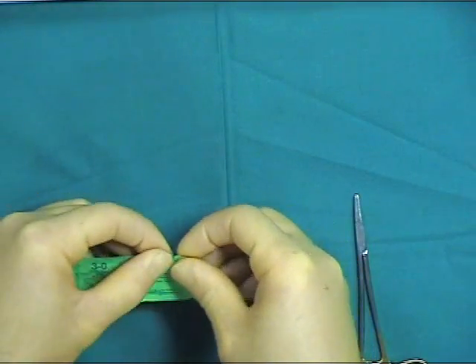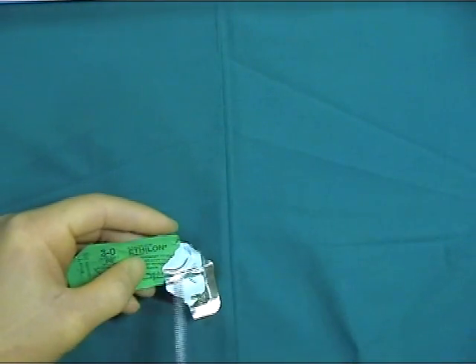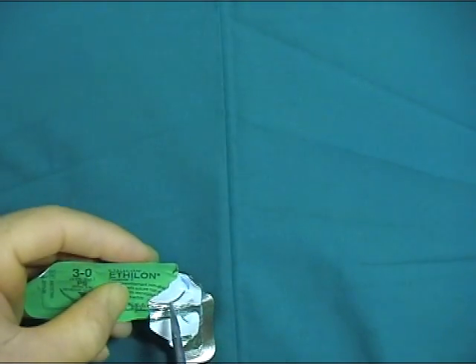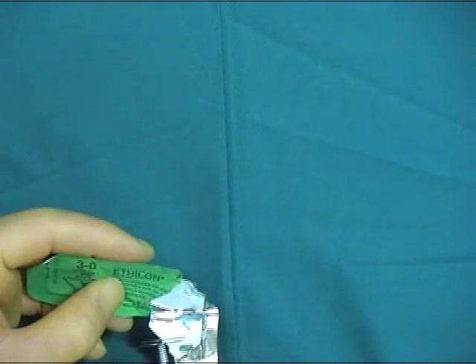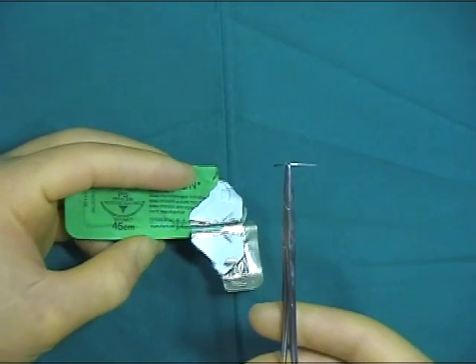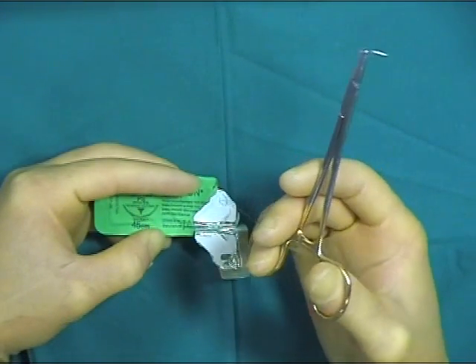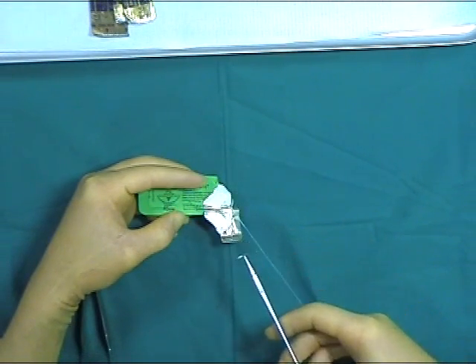After opening the suture pack, the needle is presented ready for mounting in the needle holder. When removing the suture from the pack, it is often useful to use your little finger to take up the slack in the suture.